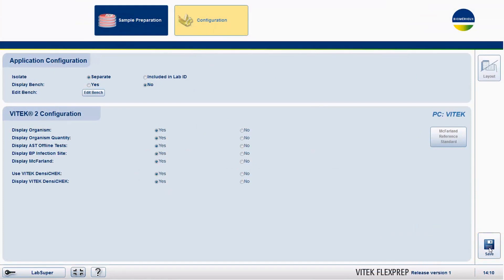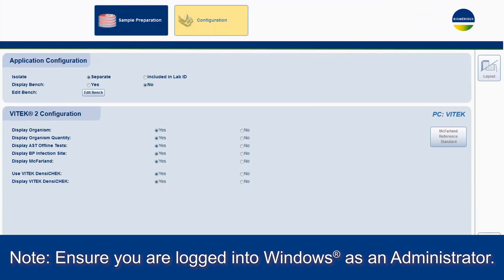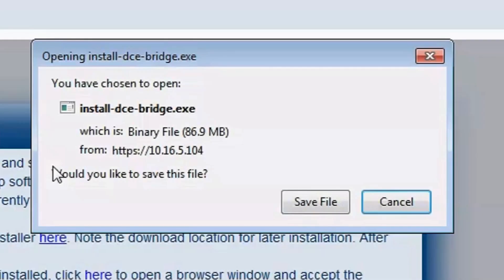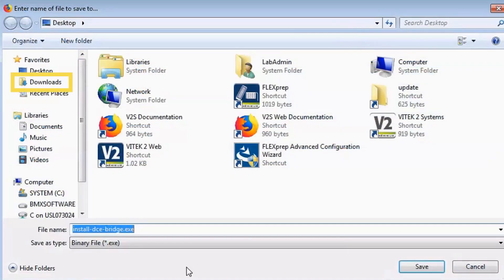Next, for remote PCs only, confirm the download and installation of the Densichek communication bridge. Note: ensure you are logged into Windows as an administrator. A warning will appear on the screen. Follow Step 1 by clicking the Communication Service Installer link. The Opening Install DCE Bridge window appears. Click Save File. When the File Explorer appears, ensure that the Downloads folder is selected, and then click Save.